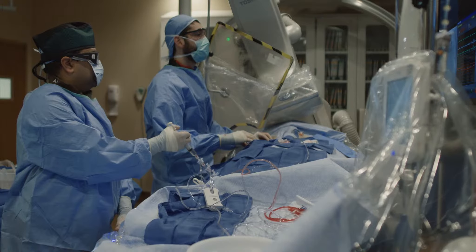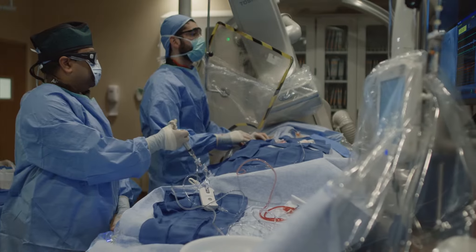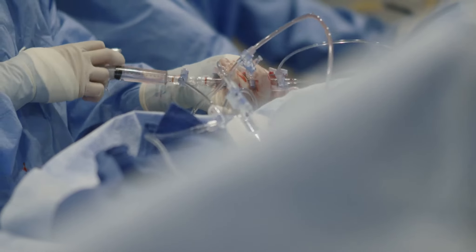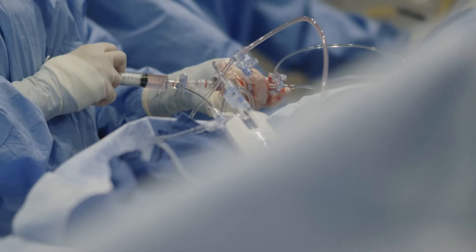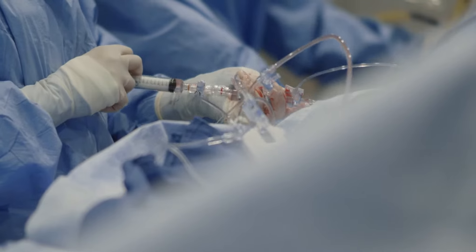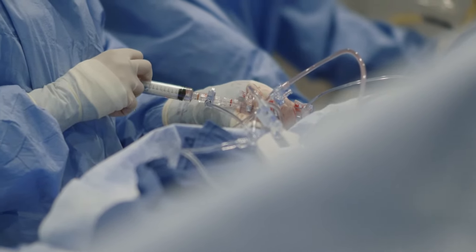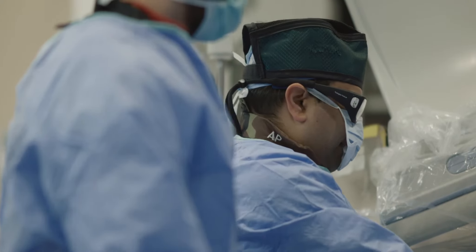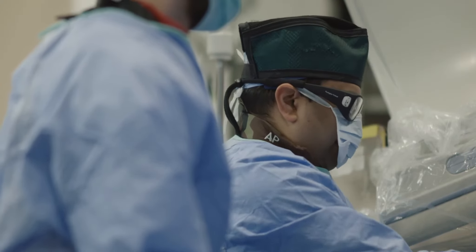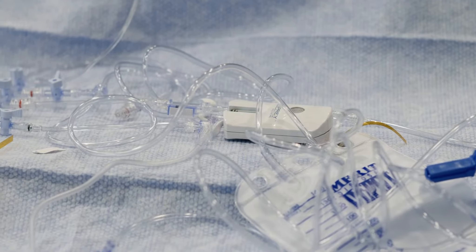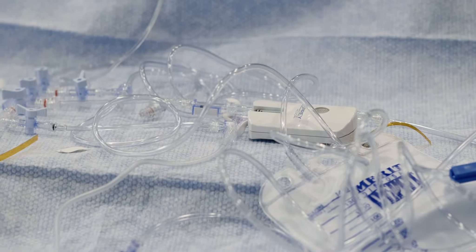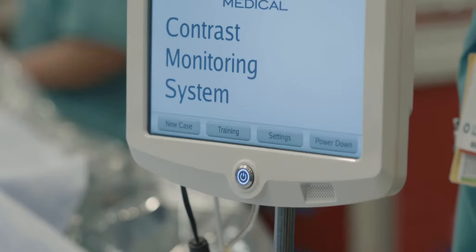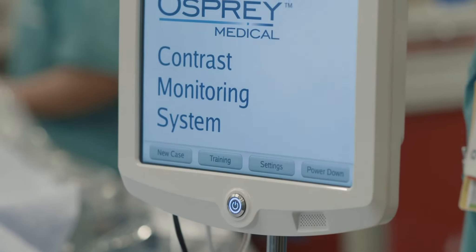It reduces contrast volume to the patient and provides real-time dose monitoring throughout the procedure. The Divert Plus Easy System is compatible with standard manual manifold injection methods and consists of a disposable module, a disposable smart syringe, and a reusable monitor.